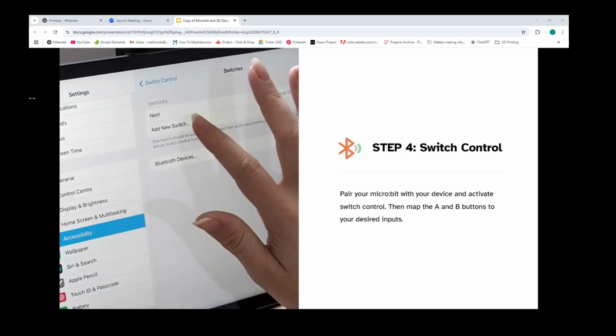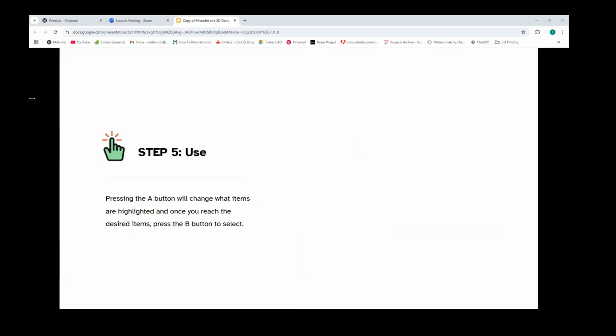But I think the thing to really hone in on is that you can go in as deep as you want into this code and modify it to do all kinds of things. We're trying to create a platform that you can then add on to, and all the documentation that we're building around this will hopefully make it easier to do that in the future.